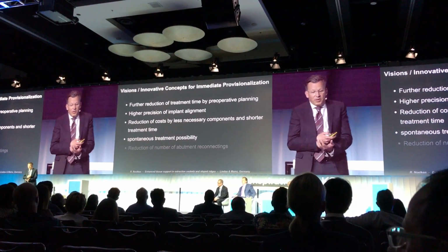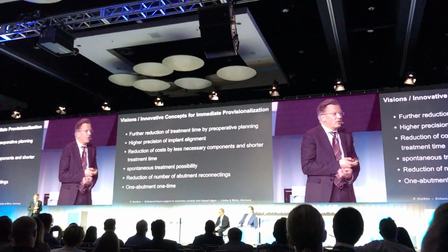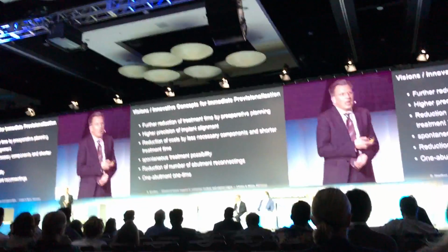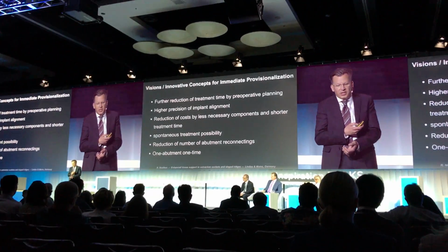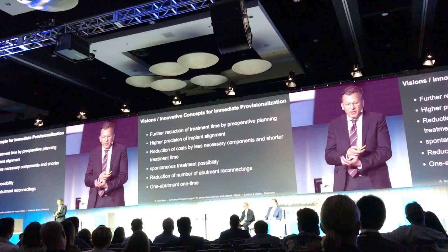We would like to reduce our treatment time by preoperative planning. We would like to have a higher precision of implant alignment if possible. And we would like to reduce the costs for our patients by fewer necessary components and a shorter treatment time.